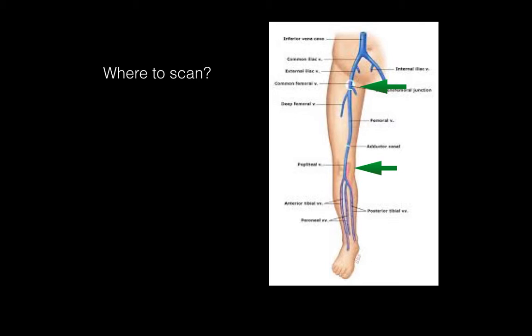The problem with this is that most of these patients were ambulatory outpatients, and they were low risk. So most of the DVTs probably were propagating from a deep calf vein or down from a pelvic vein, and it didn't include higher risk patients, which is really what we often see in the ED. And there was another more recent large retrospective study looking at thousands of patients, 2,500 patients with suspected DVT, and 15% of them had a DVT, so 356 of them. 6% of those DVTs were isolated to the deep femoral or the femoral veins, which would have been missed by the two-point compression ultrasound. And some of those patients ended up having bad outcomes. So 6% miss rate is what you would miss if you did just the compression at the common femoral and the popliteal.